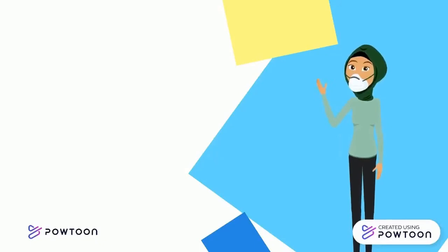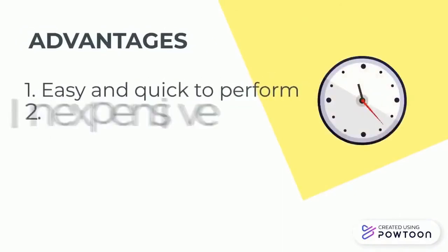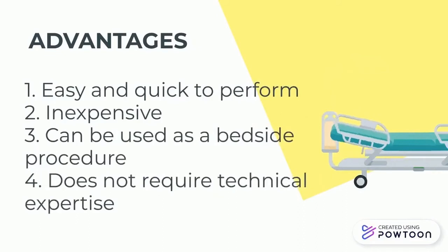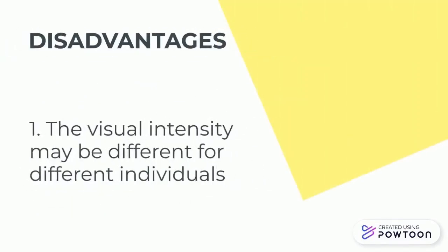Now, let's look at the advantages and disadvantages of this Sahli's method. For advantages, it is easy and quick to perform, inexpensive, can be used as a bedside procedure, and it does not require technical expertise. For the disadvantages, the visual intensity may be different for different individuals.